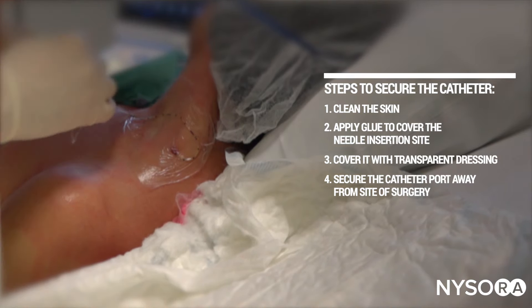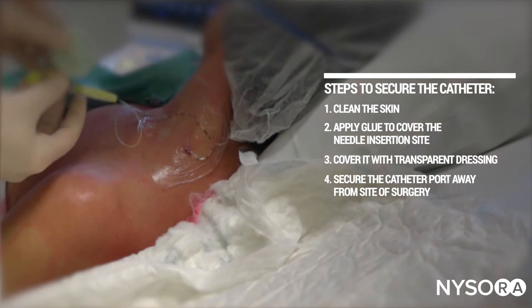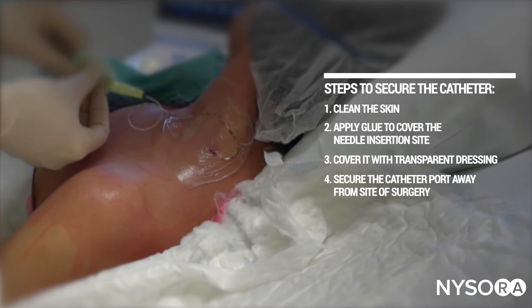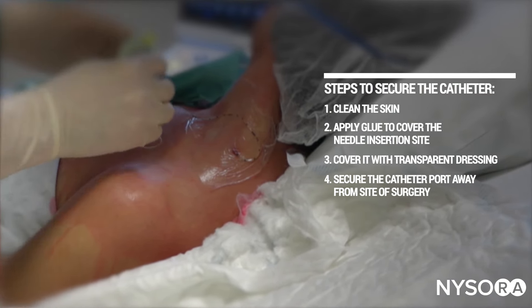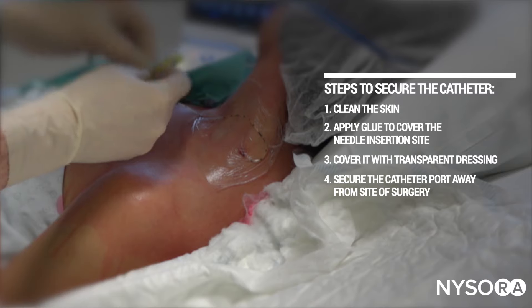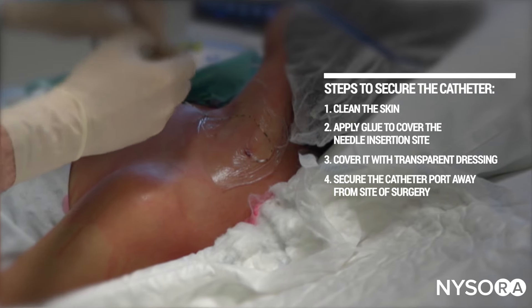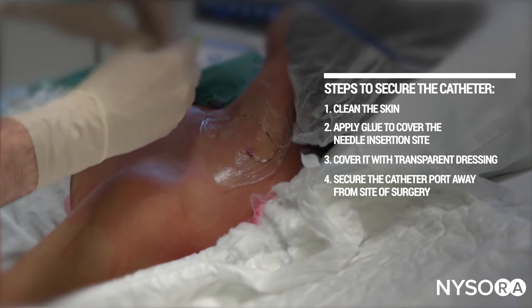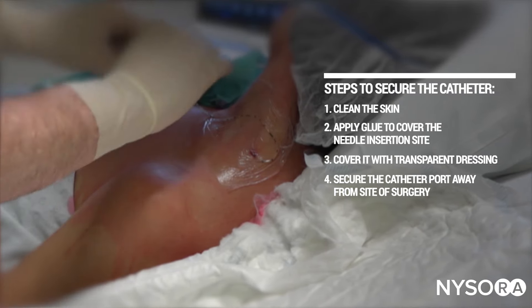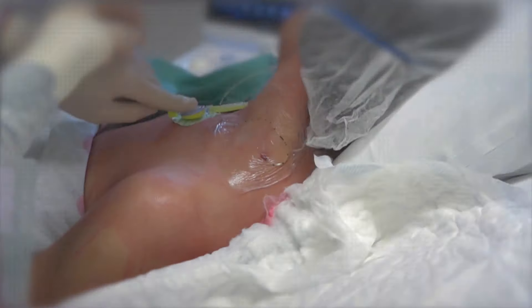The final step consists of attaching the catheter port for injection and securing it on the anterior chest wall, again away from the site of surgery.